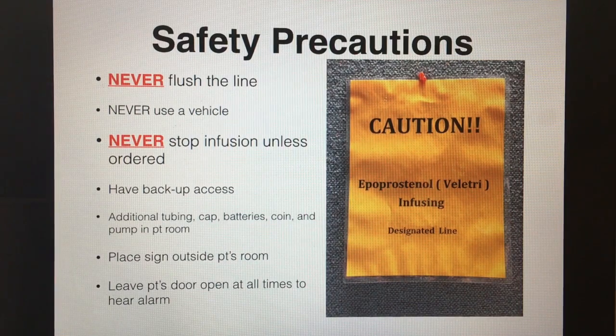You're going to place the sign you see on the right-hand side outside the patient's room so that everyone's aware these medications are infusing within that room. These orange signs are laminated and can be found on the unit in a binder.